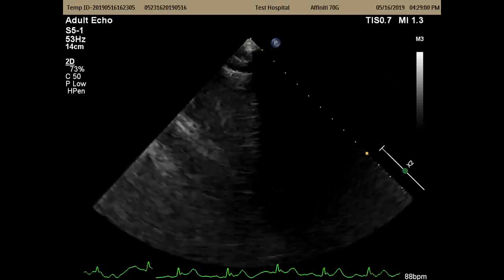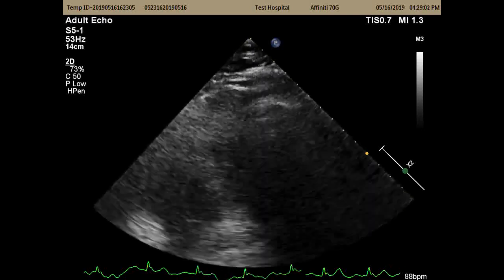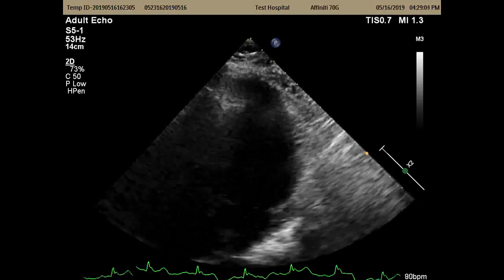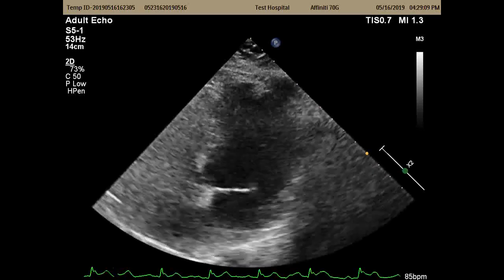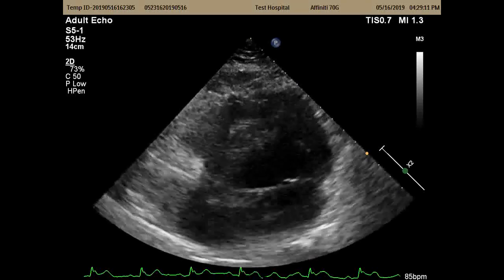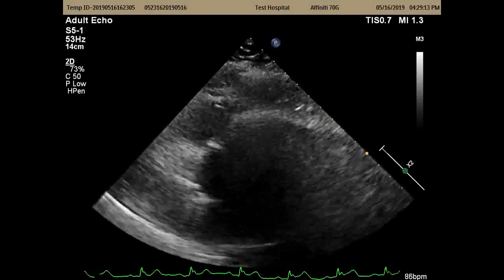All right, and I'm going to just reclip the 2, and then we'll go through the curves, okay? I was not happy with my original 2. If you're seeing an aortic valve like this, you're too high. So to see there's the aortic valve, we're too high.